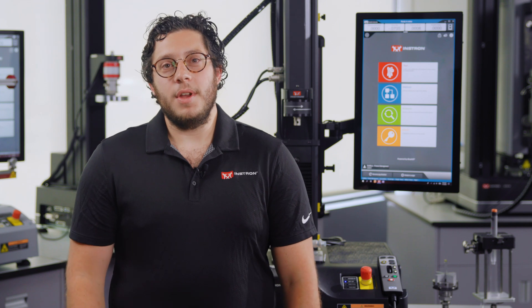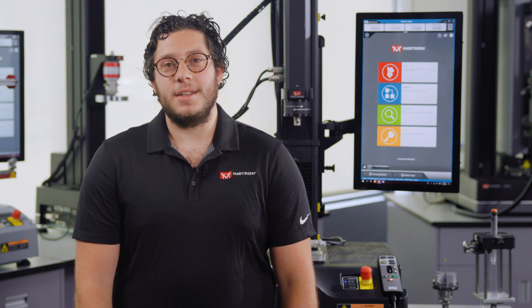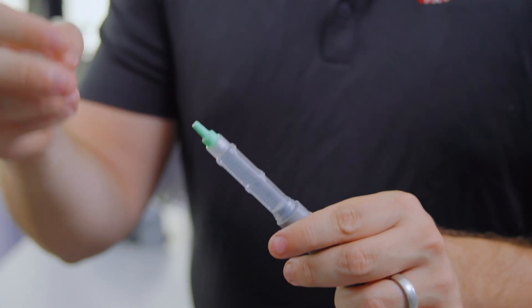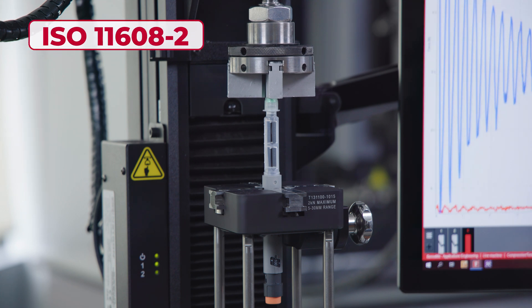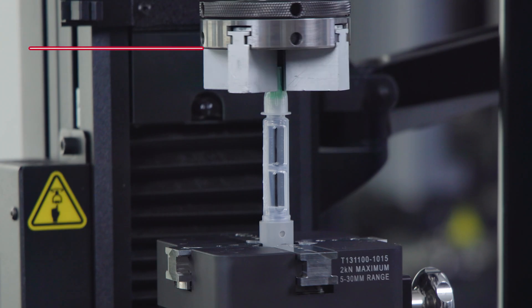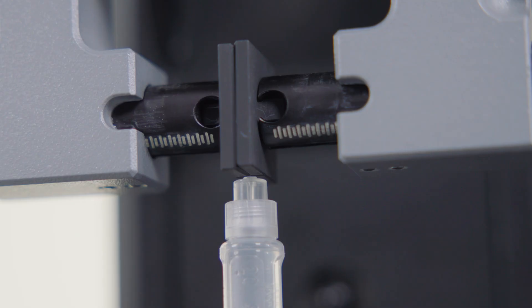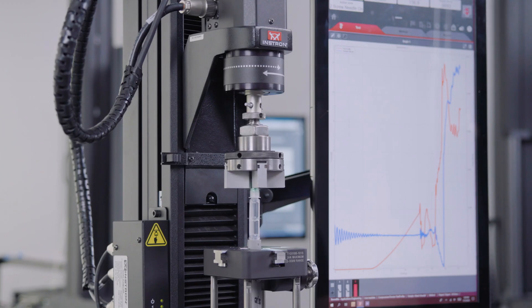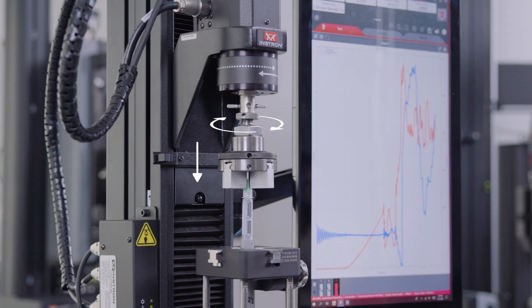In addition to an evaluation of the finished device, there are also many different components that need to be tested in isolation. One component that requires testing is the attachable dual-sided needle, which is tested in accordance with ISO 11608-2. This standard defines the torques required to assemble and remove the needle, as well as the strength of the connection between the needle and the hub. To perform this, you need a test system capable of applying both axial and torsional loads.